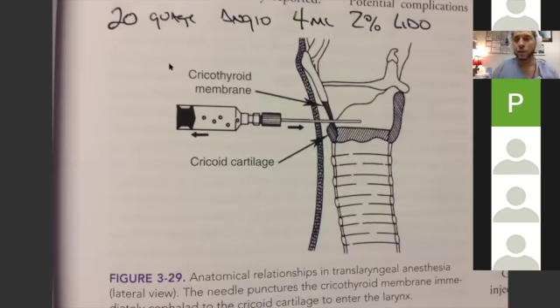You can also use this opportunity if you have a very bad airway and you anticipate you may have to do a surgical airway. This is a great time to leave an angiocatheter in the trachea. So at a later time, I have this tray here. It's an emergency cricothyroid tray. There you go. It's a Seldinger tray.